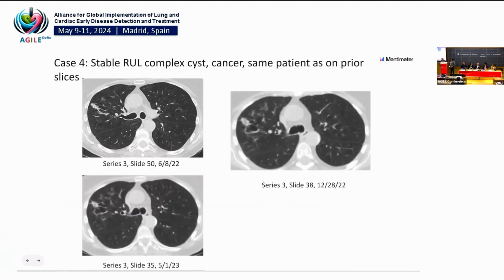Yeah, after a year. But this case is not so simple. We don't know. In this case, we really should know some data from the medical history. Then the whole story begins. I completely agree. This patient should be referred to a respiratory physician. Even if it hasn't changed for a year? I will be very happy to find out what is going on in this case. It is not a usual case. You are not looking frequently at cases like this one in everyday practice. When you have a lot of cysts, how old is this lady?